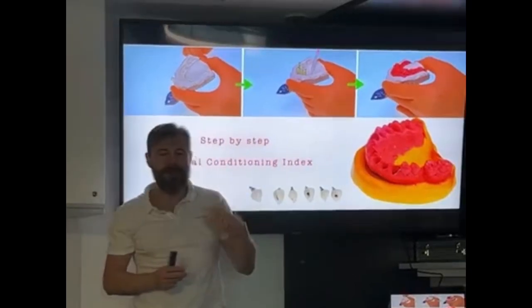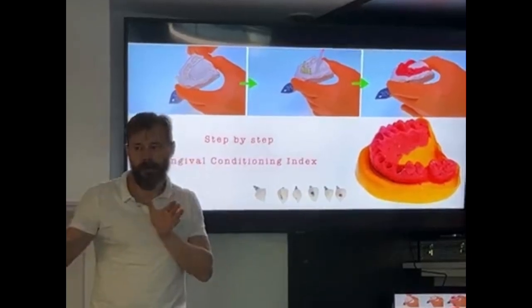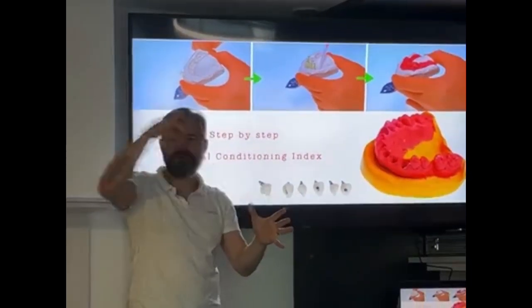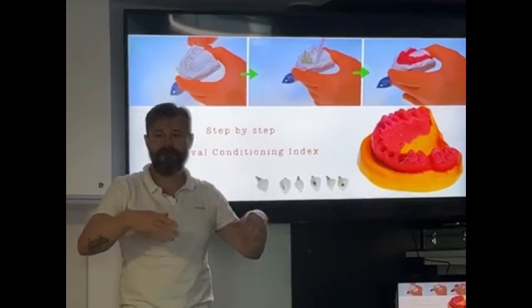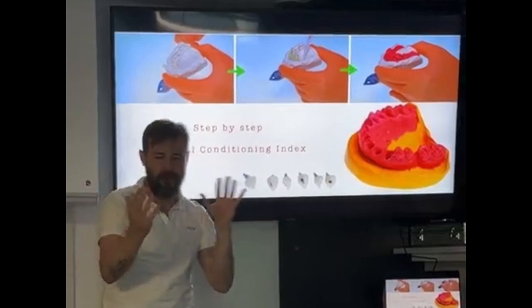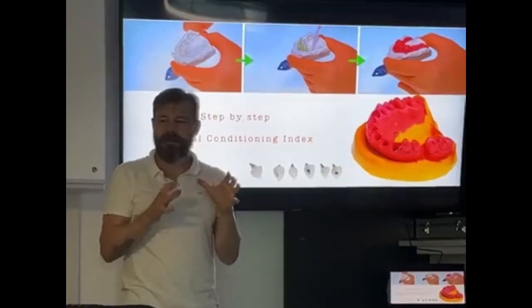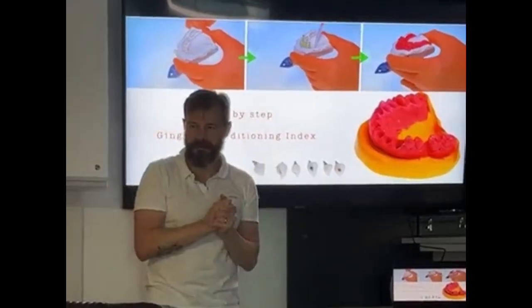But I cannot use a plaster material, gypsum, because that is going to take like 45 minutes to 1 hour. I don't like to have tissue that I really create with very good papilla, nice socket, and this tissue without any support. If you take this provisional out for sometimes 10, 15 minutes, the gingiva already starts to change. If you leave that 1 hour, you have this tissue completely melted down. You try to move back the provisional, it's painful for the patient, you compress the tissue. So all the time, the tissue that I create, I need to give some support for this tissue, right?